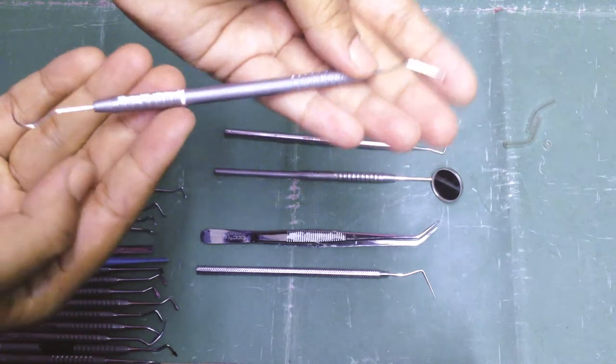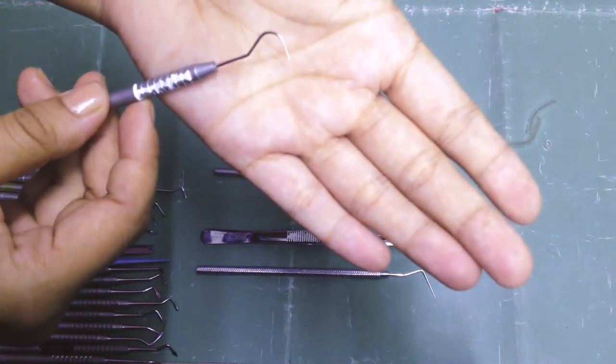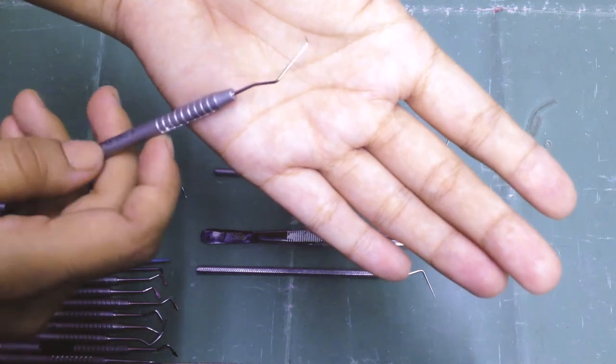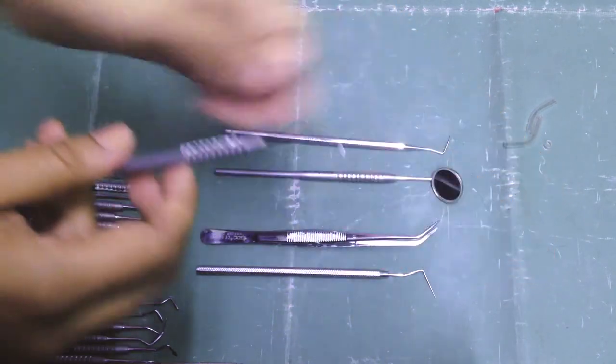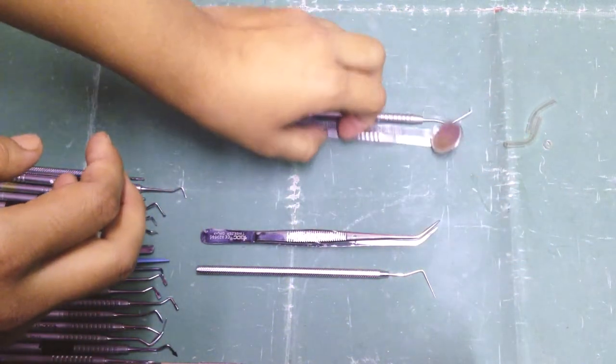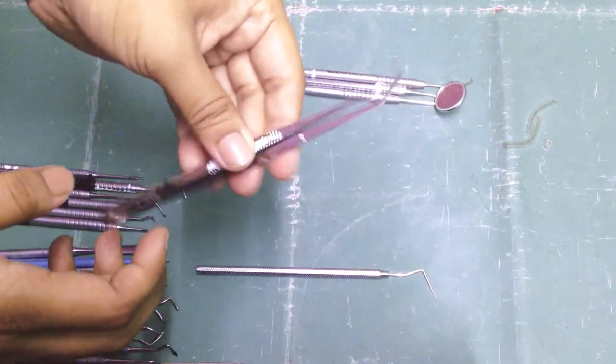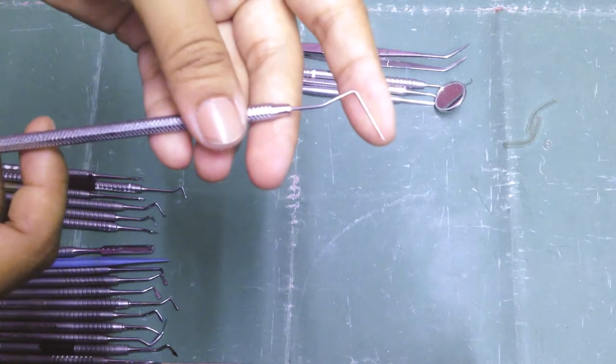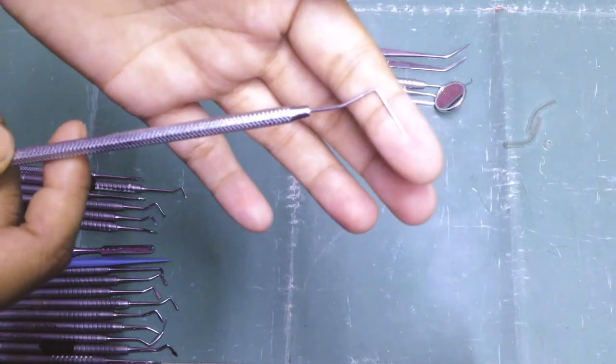This is a double-ended instrument. As you can see, this is a shepherd's hook or curved explorer, and this is an interproximal explorer, also called Bright's explorer. Then we have tweezers. We also have some periodontal probes, and this particular one is a Williams periodontal probe.